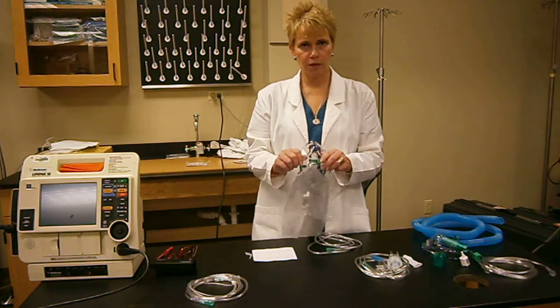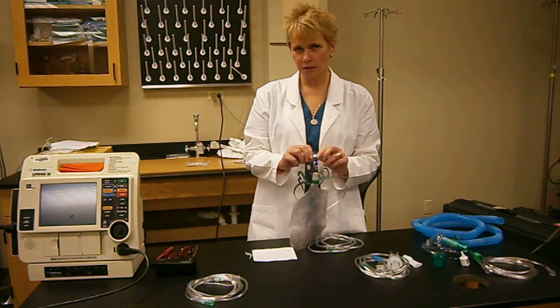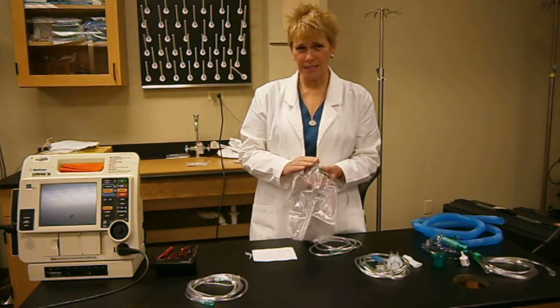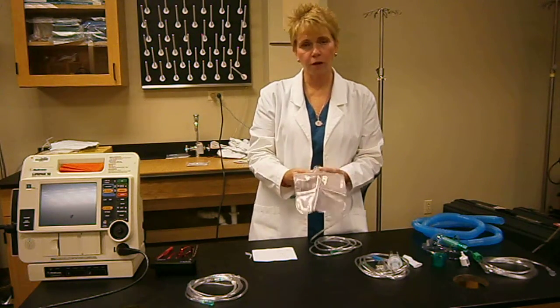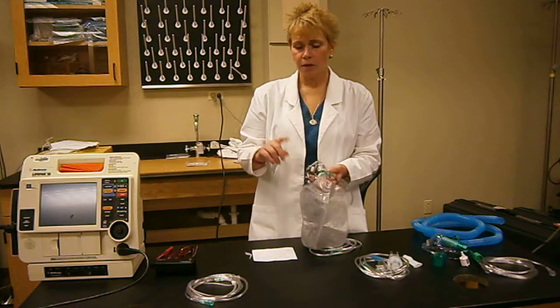There's a misnomer to this mask. It's called a 100% non-rebreather, but that's not really what it delivers. It'll probably deliver with a good seal up to 90 or 94%, but it truly does not deliver 100% oxygen, so be aware of that.